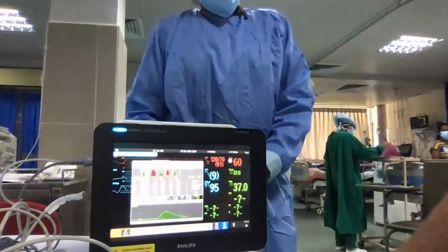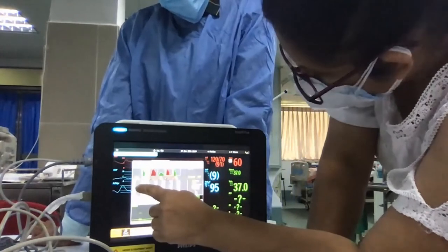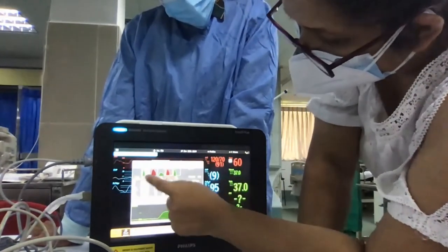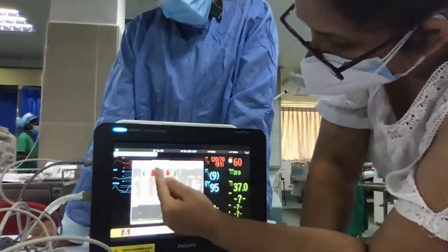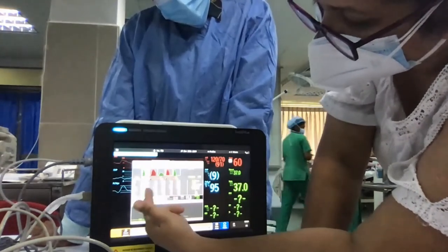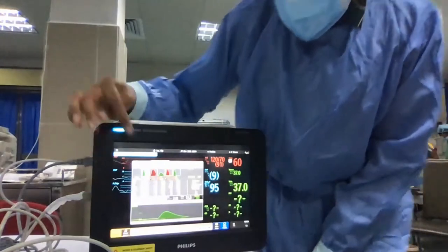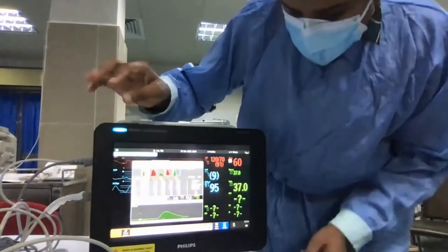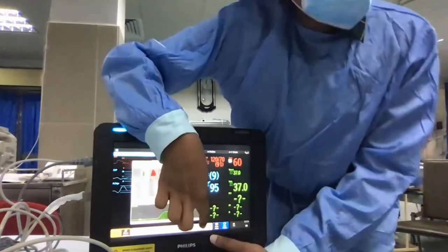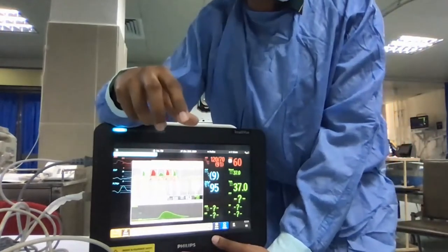Then after that, selecting the new. Here the numbers that you have got are the cardiac output parameters: cardiac output, cardiac index, and so on. All those have been calculated for each bolus. So you select at least three, the numbers that are quite similar to each other, and then get the average at the end. After that, what you have to do is save cardiac output and calibrate continuous cardiac output. Continuous cardiac output is where we get the pulse contour measurements.